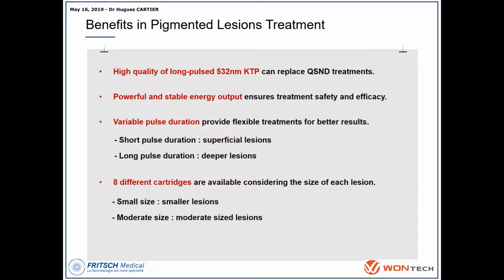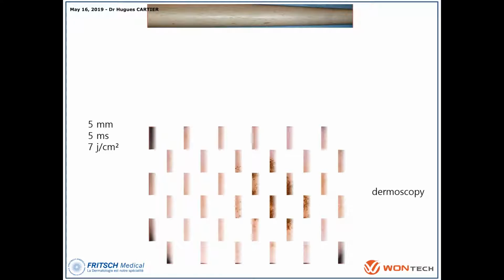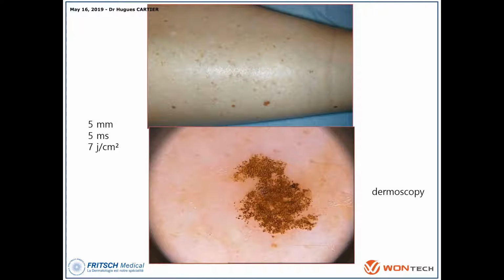You can modify it in the same session to destroy superficial skin disorders like dark spots, and also rejuvenate the patient superficially; you can also use only the green light, the 532. But if you want to induce skin remodeling with a deeper action, you can combine in the same session the 1064 to induce a thermal effect as well, with neocollagenesis. I will show you some pictures.